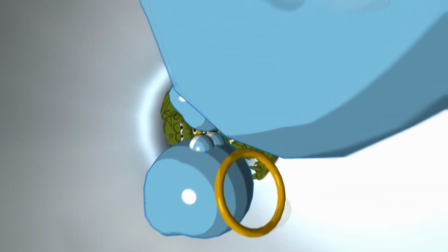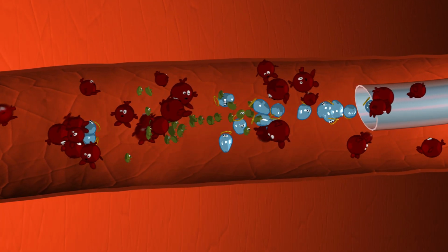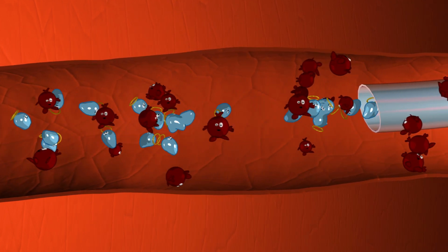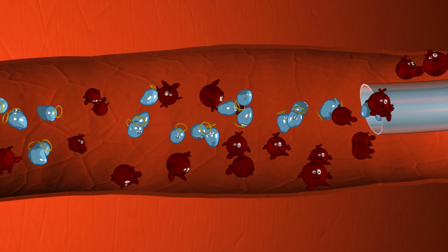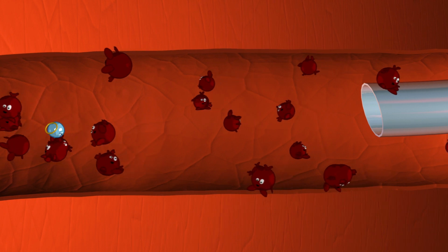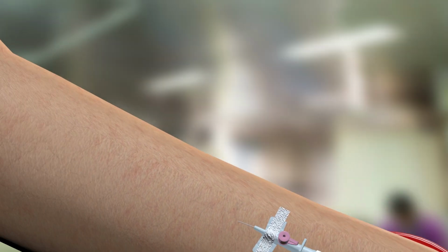To minimise stasis and platelet activation, best IV maintenance practice may be a combination of slow, continuous infusion combined with regular intermittent flushing delivered with a gentle technique to minimise the inflammatory response. And this means a happy vein, a happy IV catheter, and a happy patient.